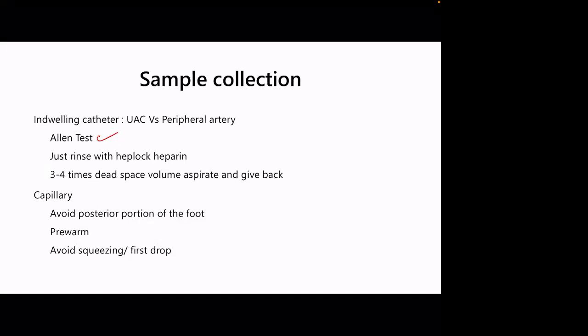And the syringe should be rinsed with heparin at a lower concentration, because heparin itself is an acid. So an increased quantity of heparin can cause acidosis.